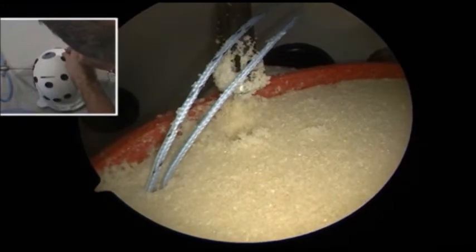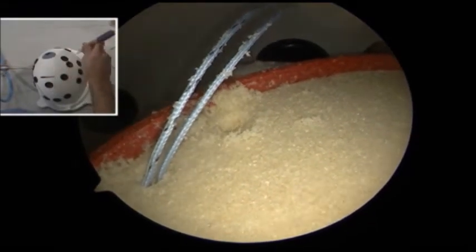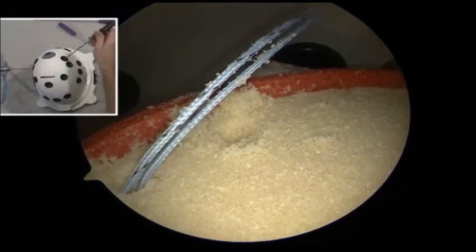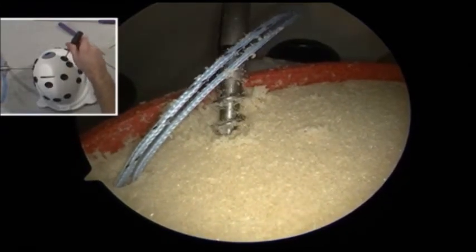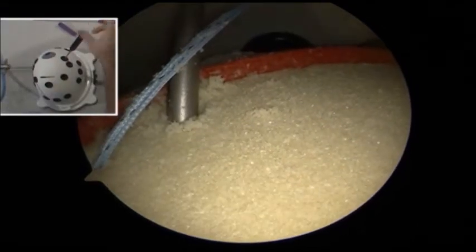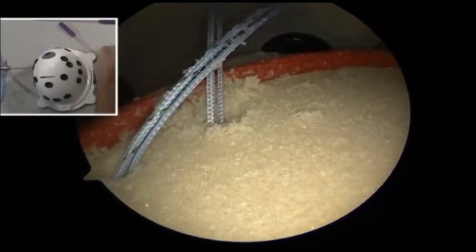Giving it a little tug. You can see that this more simulates osteoporotic bone and the anchor pulled out. So that anchor pulled out, as it might if you were doing this in somebody with poorer bone quality. If that occurs, you can choose a slightly bigger metal suture anchor and come in the same trajectory and then screw that into place. Again, down to the laser line. If you give that a little tug, that's got much better fixation within the bone.